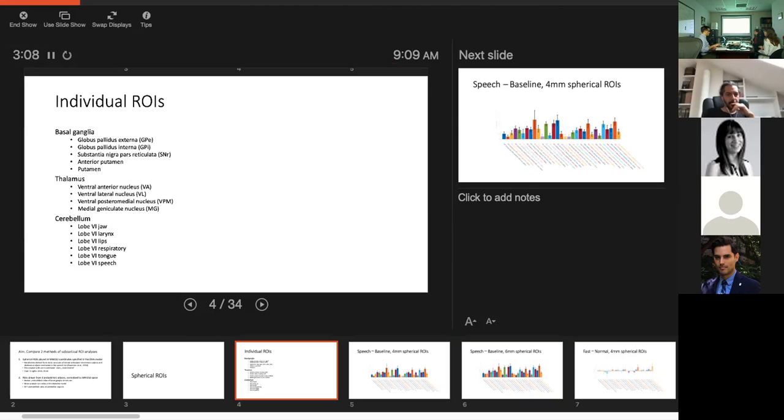Versus the DIVA ROIs, which are just the ROIs that are active. The speech lab ROIs are based on cortical anatomy, whereas the DIVA ROIs are based on our previous studies and some meta-analyses that Frank ran, trying to find centroids, the localized components of the DIVA model. In practice, when we talk about them, they're defined in MNI space, whereas the speech lab ROIs are defined according to sulci and gyri anatomical landmarks.